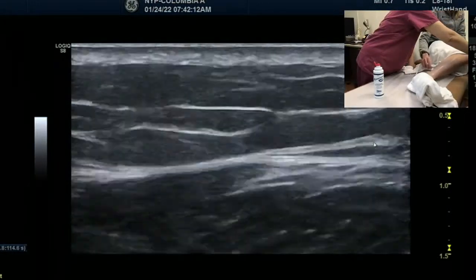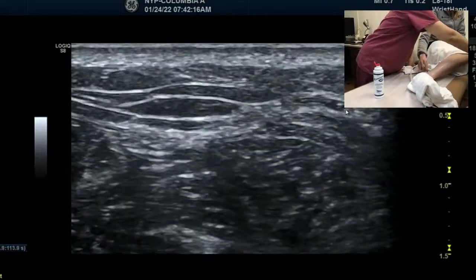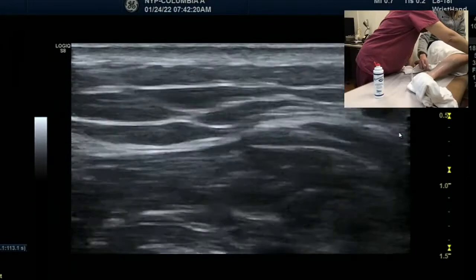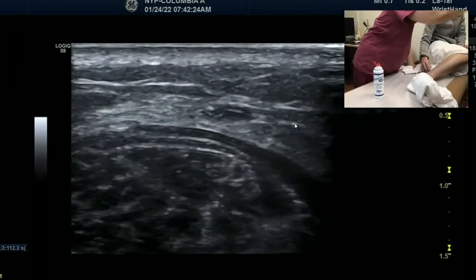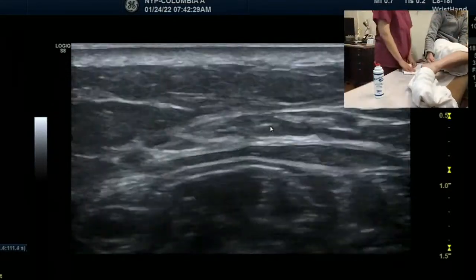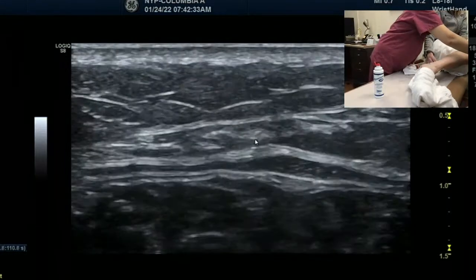I don't see. There it is. Here. This one, and then follow that one. Here. I have to go this way. A little posterior to the right, more medially, you have to move your probe. Okay, that one. Here. Yeah, and this one then.